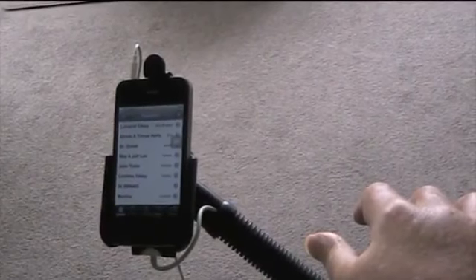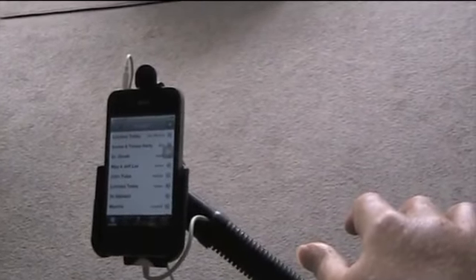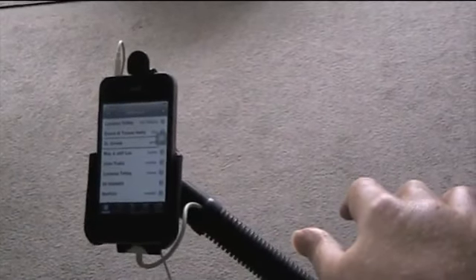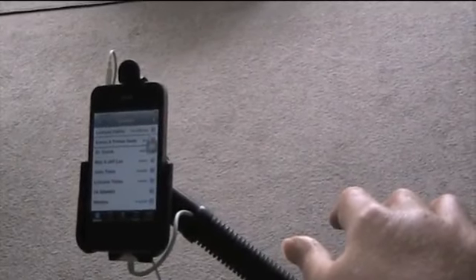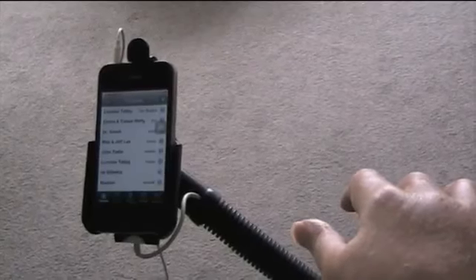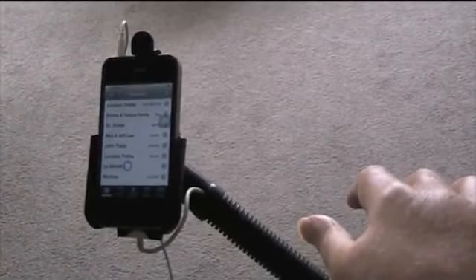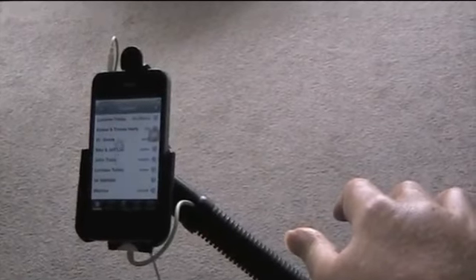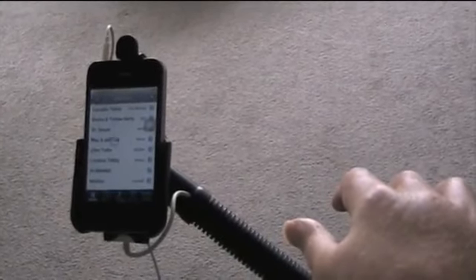Recently Dynamics released an upgrade for the iPortal and this uses Apple's assistive touch. So whereas before I was using the voiceover and moving through the menus as if they were buttons, the new upgrade allows me to use the screen with more of what I call a joystick. So I hold down on the right hand pad for about 3 seconds and that brings up the assistive touch icon on the screen. And now instead of moving with buttons, I'm using the head controls to navigate through the different ways on the screen.